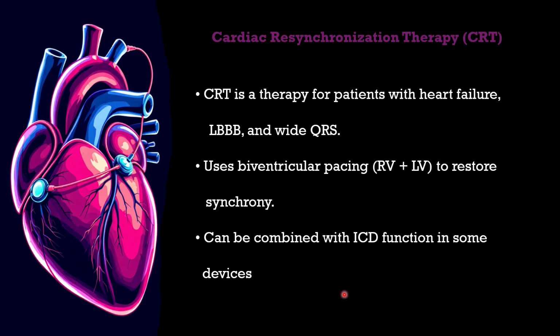Cardiac resynchronization therapy is used for patients with heart failure, left bundle branch block, and wide QRS complex. It can be used for biventricular pacing, right and left, to restore the synchrony between the right and left ventricle. Also, it's combined with ICD function in some devices, which will have coiled leads to give a shock for a patient with any tachycardia.